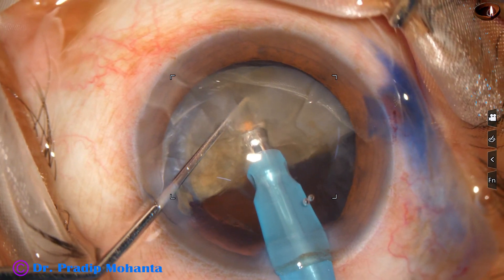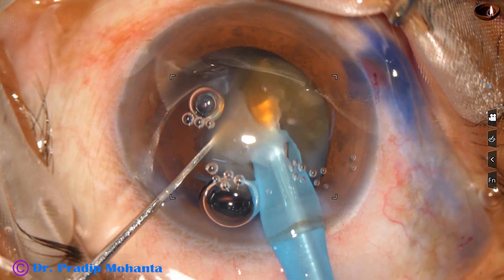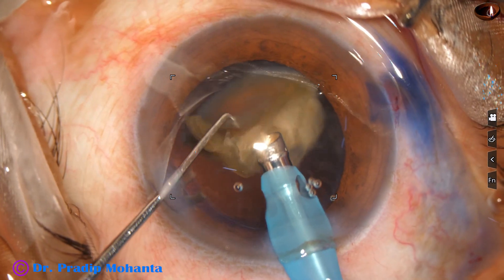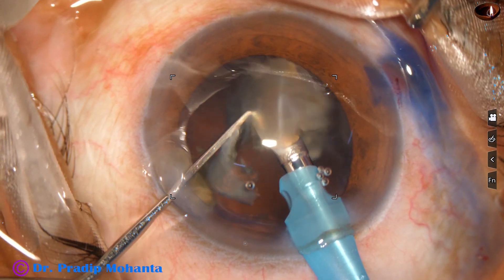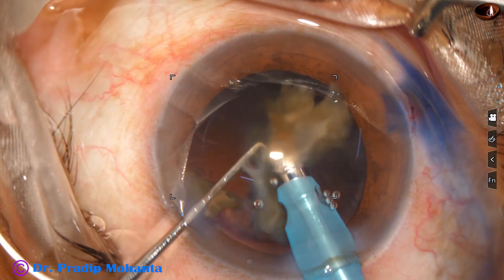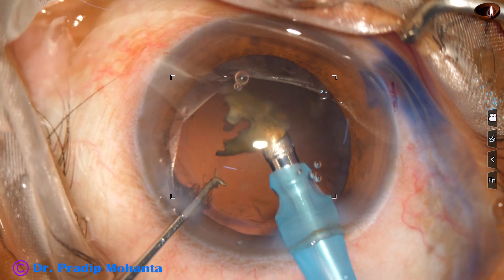The other hemi-nucleus is chopped into two pieces. The two pieces were not completely separate, but both are emulsified — this is the last nuclear fragment. The tip of the phaco needle is kept always at the central 3 millimeter safe zone where the anterior chamber depth is maximum and the posterior capsule is far behind.